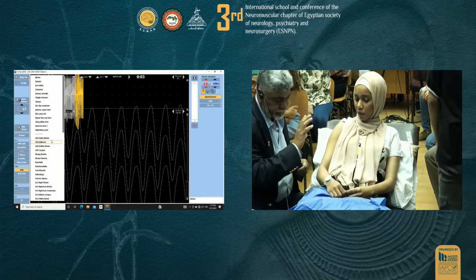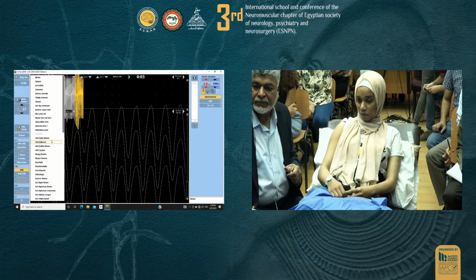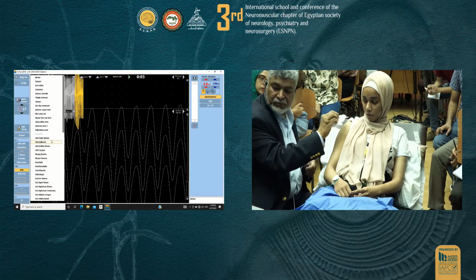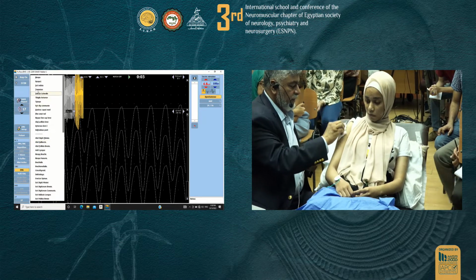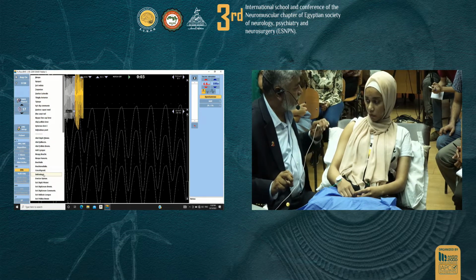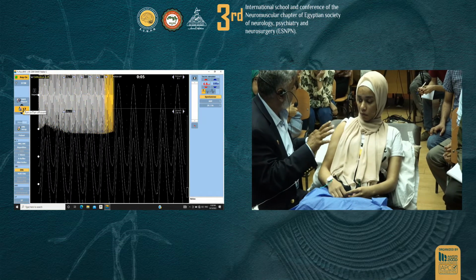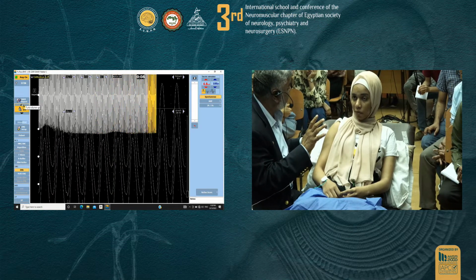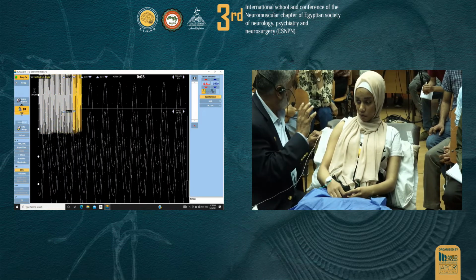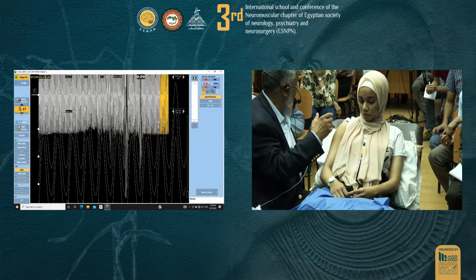We'll shoot this muscle, okay? A little bit, not that much, but that's fine. So sound on, please. It's a combination of what you see and what you hear. EMG is a lot of hearing. The sounds are very classical. If you've got enough experience, you don't even have to look at what you're seeing, because your ears will tell you. Okay, so I'll show you what I mean. Your ears get trained over time to recognize fasciculation, fibrillation, CRDs, myotonia.